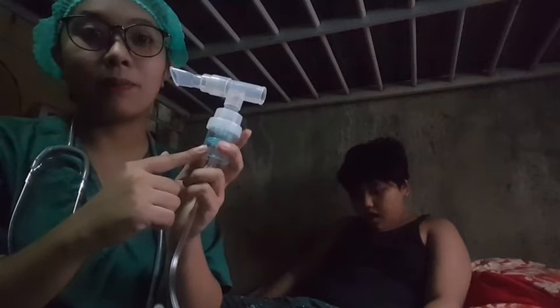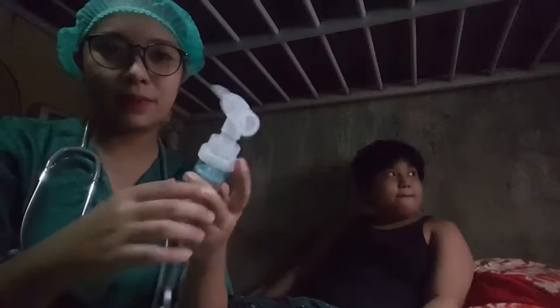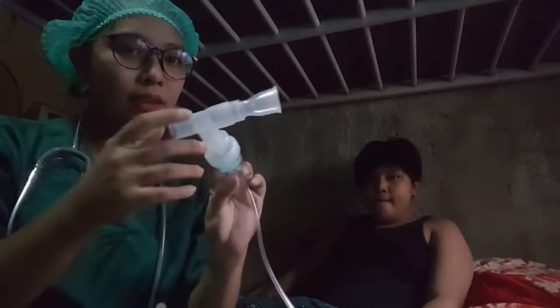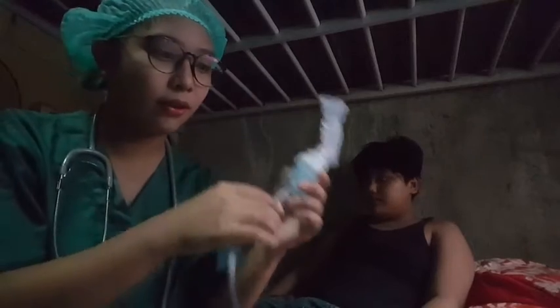In the bottom section of the cup, use a dropper to place the prescribed dose of medication and a diluent as required. Then screw the top portion back on, and attach one end of the tubing to the bottom of the nebulizer and the other to the air compressor.